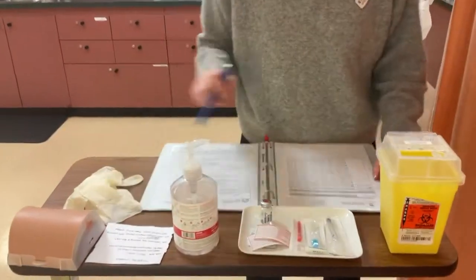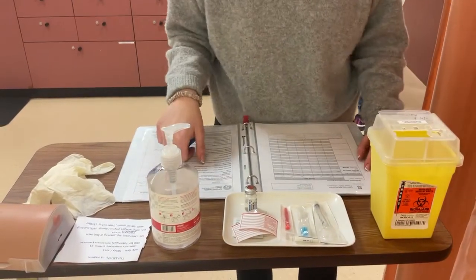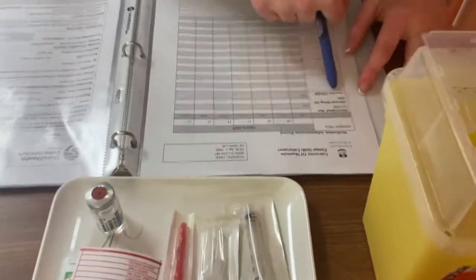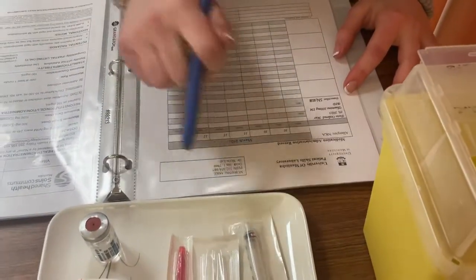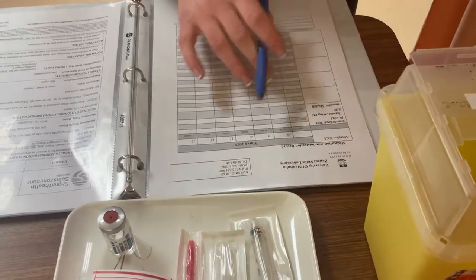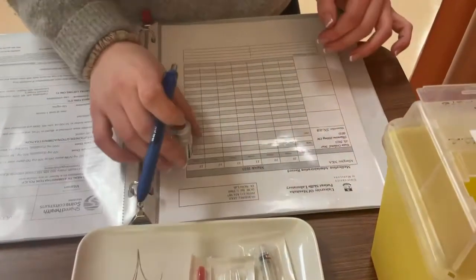So to begin, I see that I have the medication administration record, the MAR, and I don't have the physician's order. I see that it has already been transcribed, so that's good. So I will just work off the MAR. I have my patient, Nursing Jake, health number, and date of birth, January 1st, 1960. He has no known allergies, but I will confirm that at the bedside.